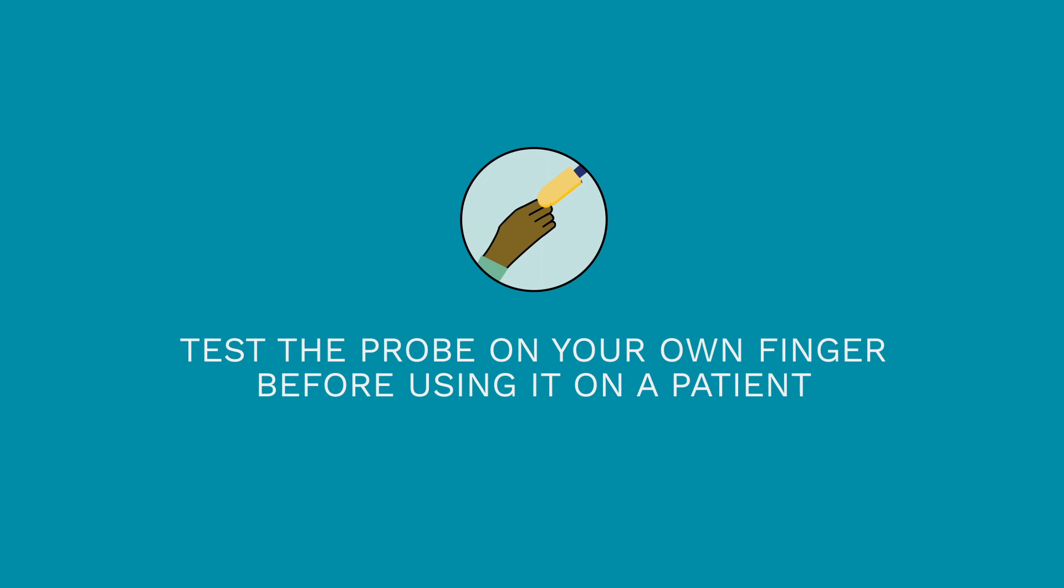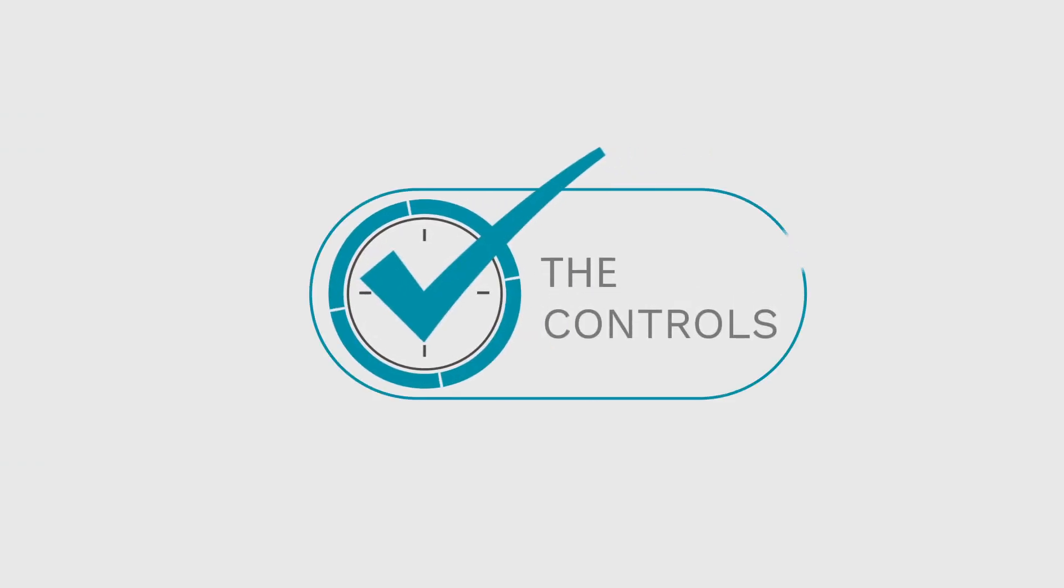Test the probe on your own finger before using it on a patient. Assuming you are healthy, you should get normal readings for your oxygen saturation and heart rate. So now that we know how to set up the oximeter, let's talk about the controls.